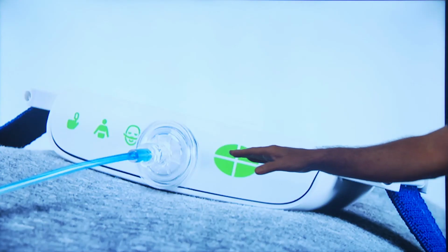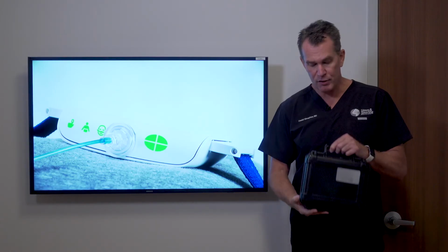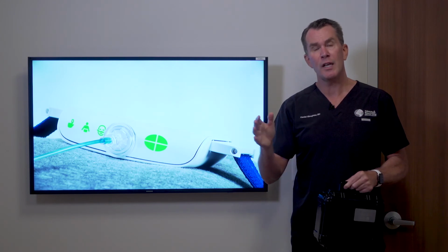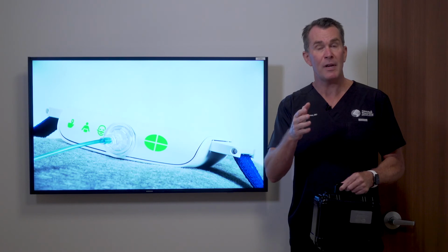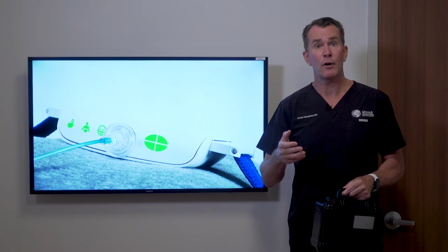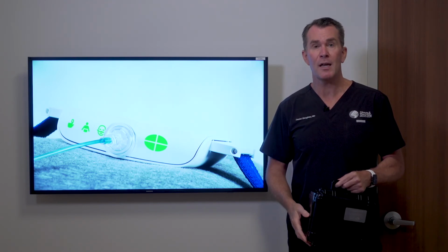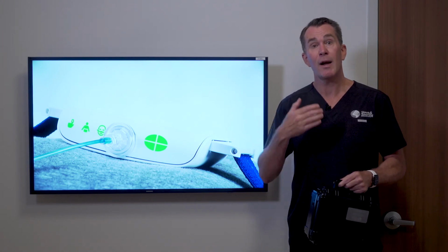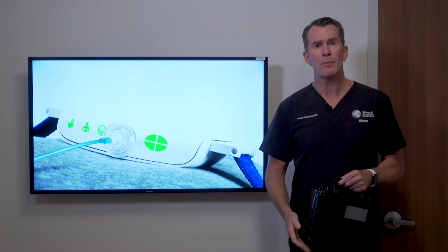Now, the device itself, after your night of sleeping, turns itself off once you disconnect it, and the box is brought to the office and plugged into a computer. And it'll go through a process of downloading the data for all the hours you were sleeping to analyze for episodes of apnea. And it can be calculated, meaning the number of episodes of apnea that's occurring per hour, to give us an idea if you do or do not have obstructive sleep apnea and what the severity of that is. Really, the first step towards getting it corrected is to understand that, because many of the therapies depend upon also the severity of the apnea that's present.